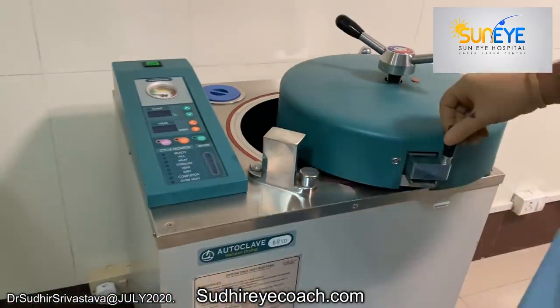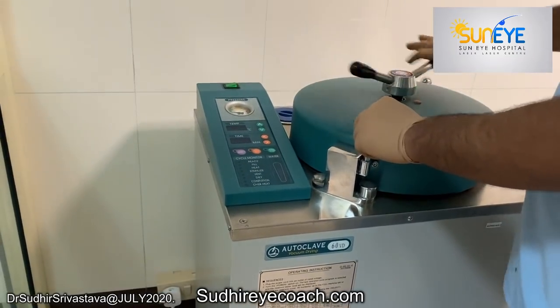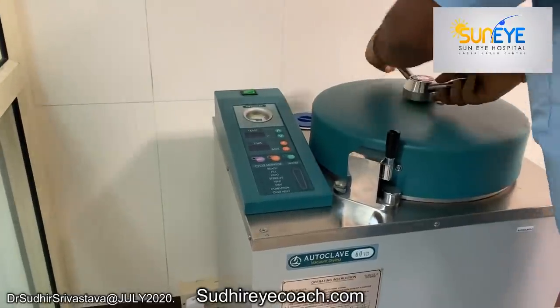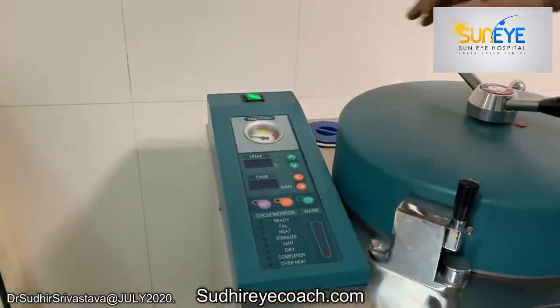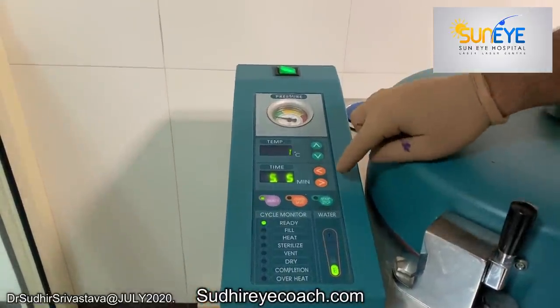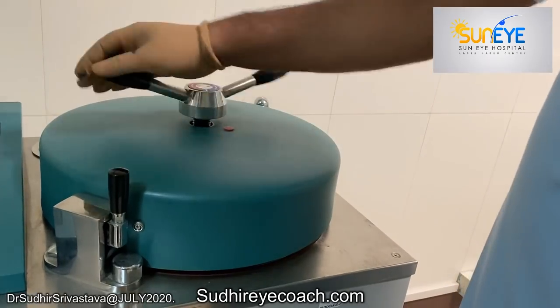This daily test we do with the daily Bowie-Dick test. The test is designed to check whether air was properly removed from the chamber or not. Even a small amount of air inside the chamber can create a problem. Therefore, proper removal of air is mandatory for good sterilization — that is what this test is designed to do.